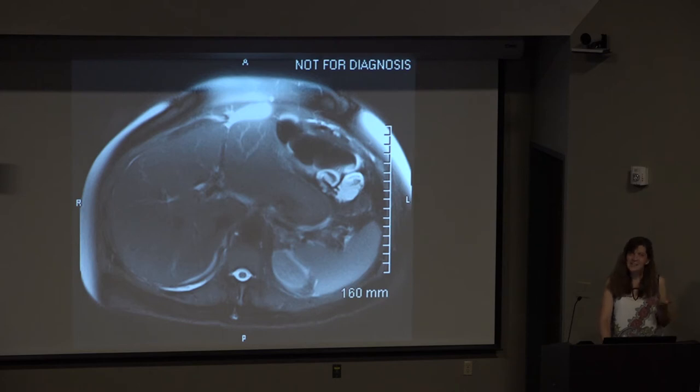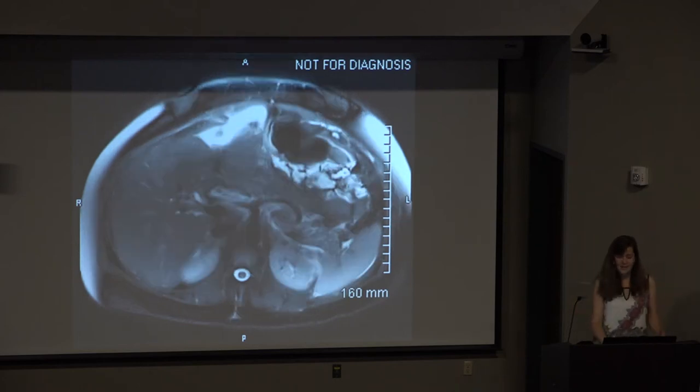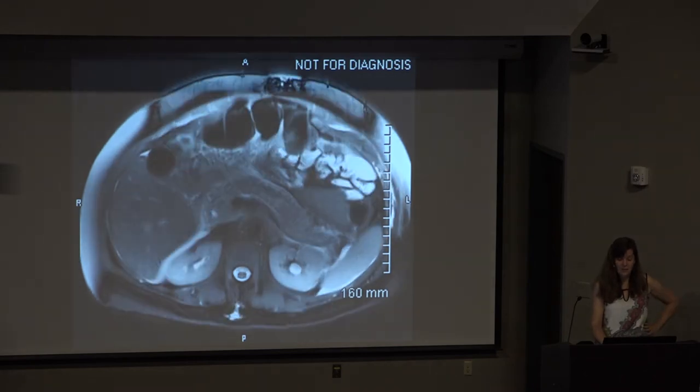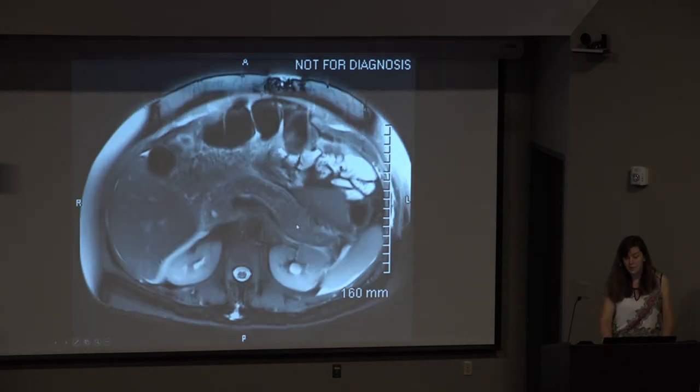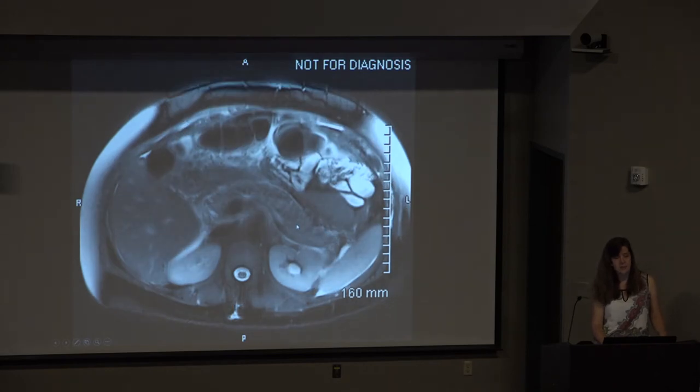And this is the ER. I mean, there's lots of things going on. We get it. But what we noticed is that there's a lot of fluid up in the upper abdomen. And this piece of tissue here, this is the pancreas. And there's a lot of white lines in the pancreas, which is edema. So we said, well, can she have pancreatitis? Because there's a lot of fluid in the retroperitoneum and it looks like there's edema in the pancreas. And that is what she has. They drew an amylase and a lipase. So nothing surgically to do here.